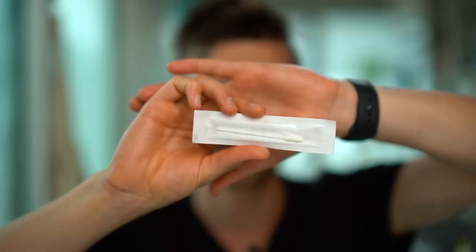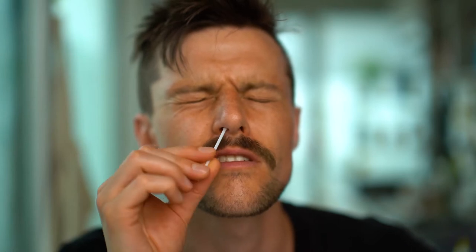Okay, so this is actually really easy to do. Here's the swab now. Okay, here we go — ten seconds. Two, three, four, five, six, seven, eight, nine, ten.